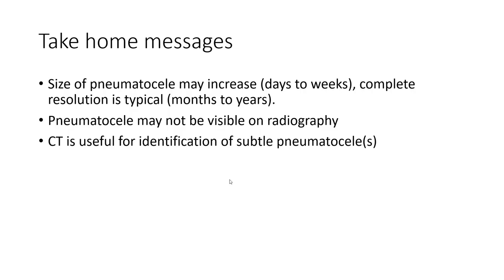Take-home message: size of pneumatoceles may increase over days to weeks, while resolution is typically over months to years. Pneumatoceles may not be visible on radiography. CT is useful for identification of subtle pneumatoceles and associated abnormalities. Thank you.